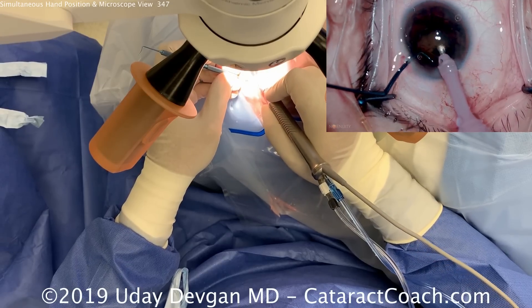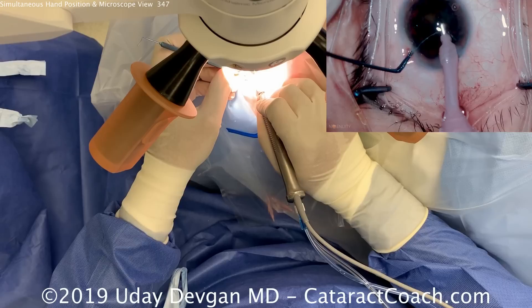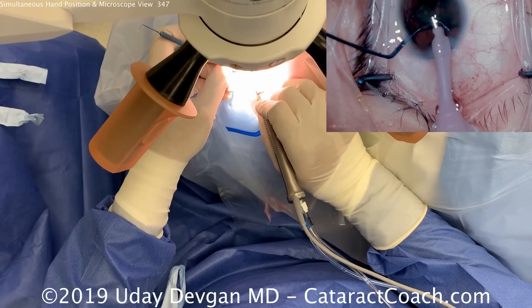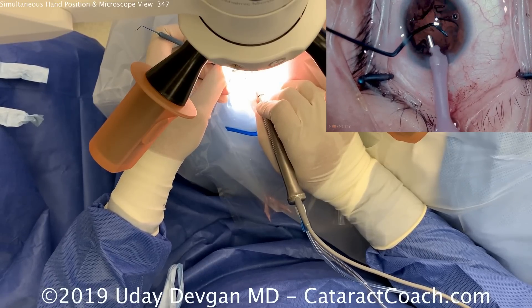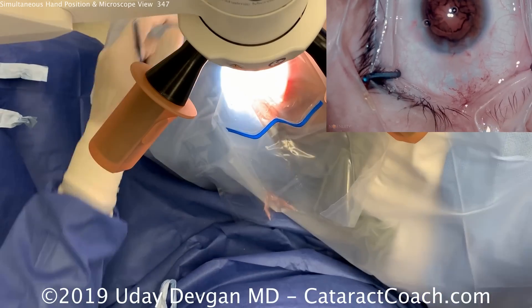Again, look at the position of the hands — each hand holding like a pencil. Look at the position of the phaco probe, almost parallel to the floor of the room, parallel to the iris. The left hand with the chopper is pivoting and moving around to position the chopper in the eye. The pivot point for both hands is the incision.